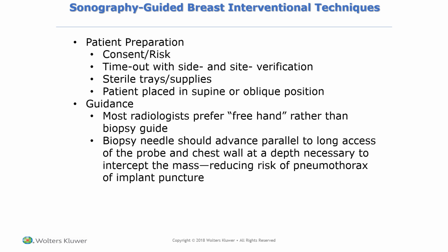The essential thing is that you're always monitoring. If you're the one scanning, you're always going to be monitoring the tip of that needle to ensure that you know the depth that tip is at. If you get off axis of the tip, there's a possibility that they could advance it too far within the breast, take a biopsy from the incorrect place, or even go so far as to cause a pneumothorax by nicking the lung.